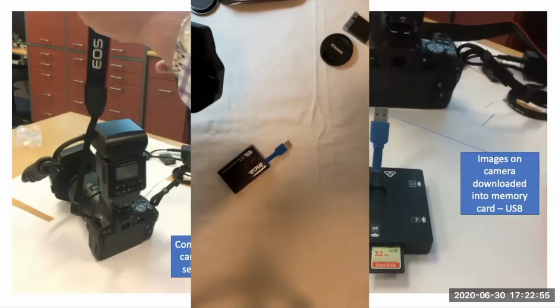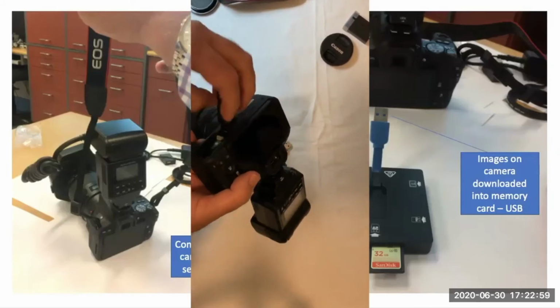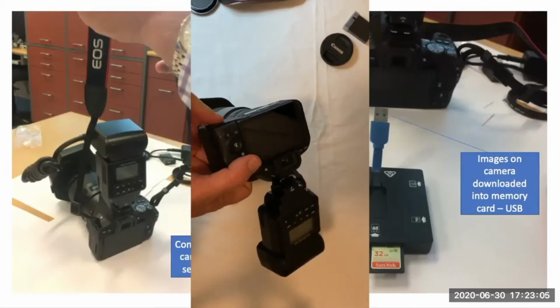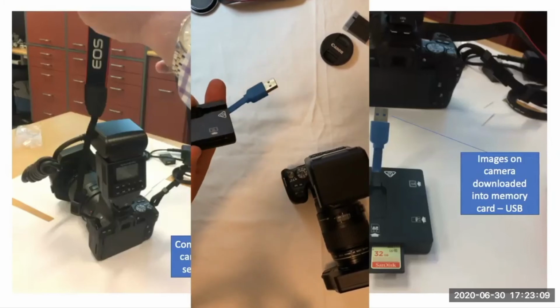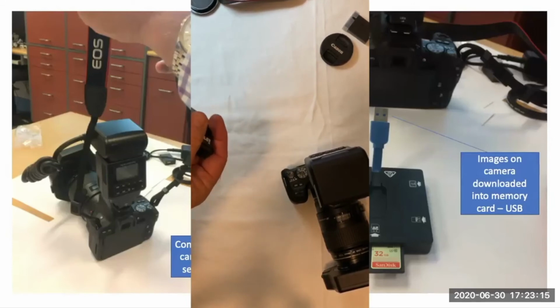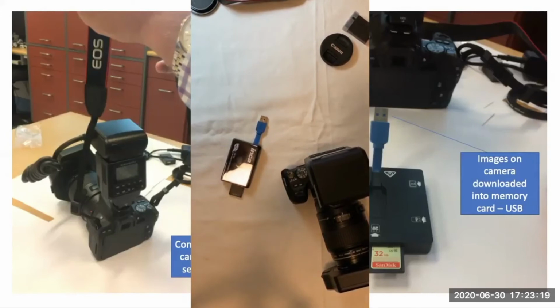And of course, these beautiful photographs that you're taking are no good unless they become part of the patient's record. So to get them to do that, take this back out again, the little SD card that's got all your photographs on it, and stick it in the right socket with this one, and plug it into your computer, load it on.